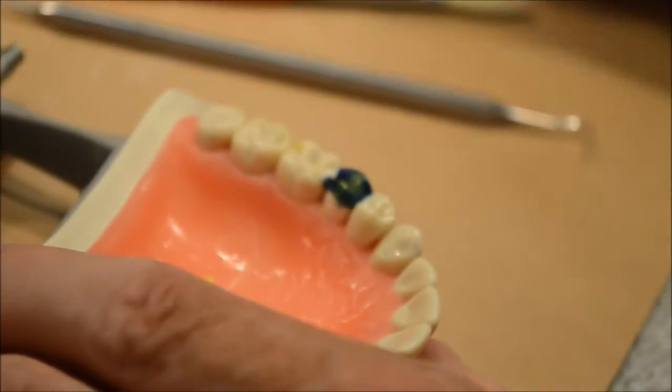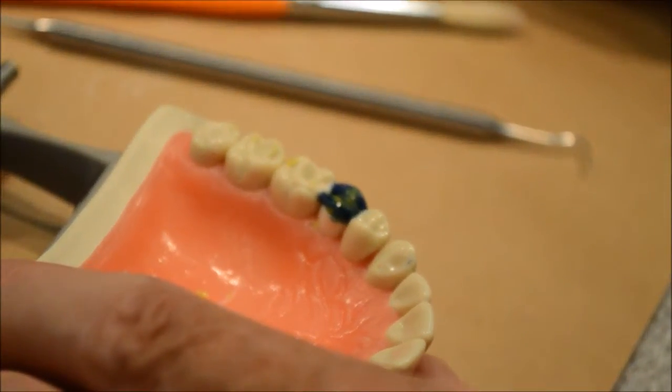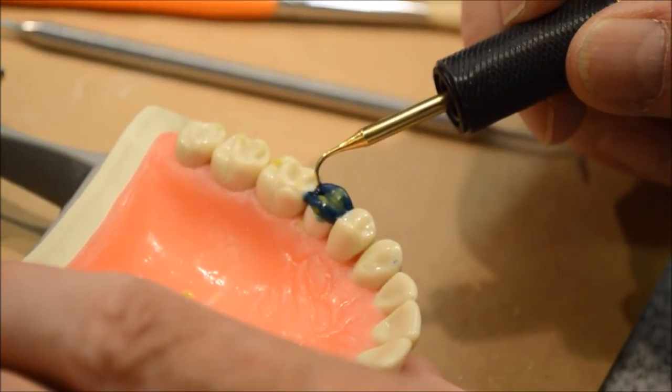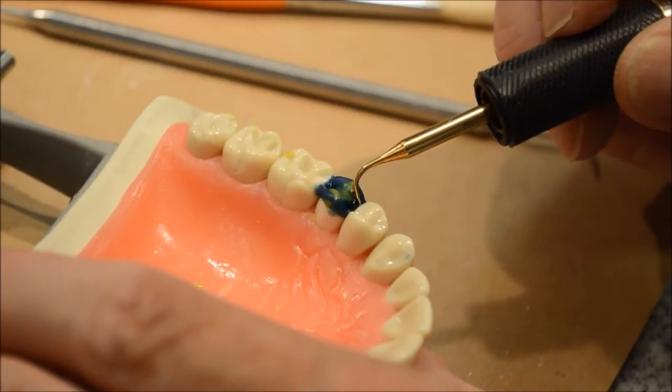The reason I'm going all the way over to the adjacent teeth is because I'm going to carve what they call embrasures. I'm also going to put a marginal ridge in here and a marginal ridge in here, and that's in blue also.